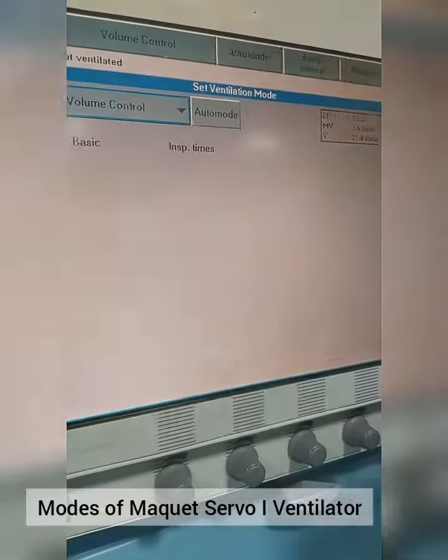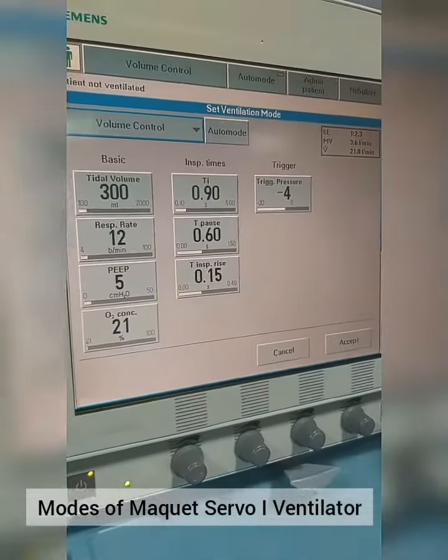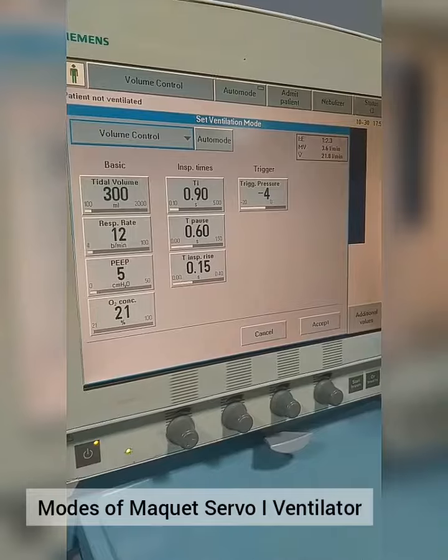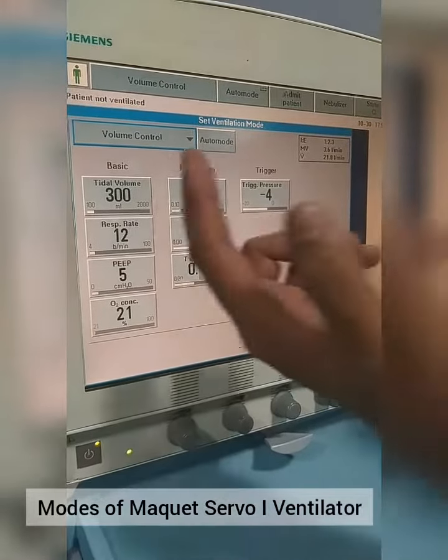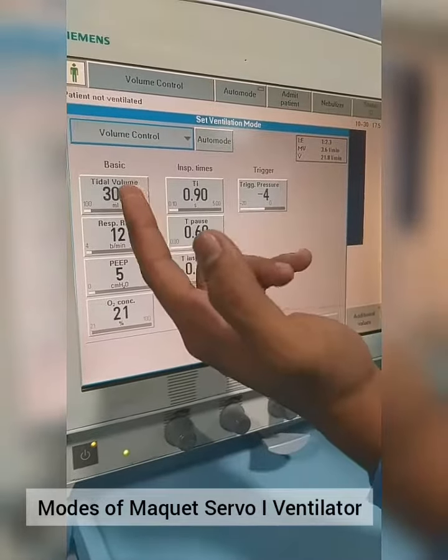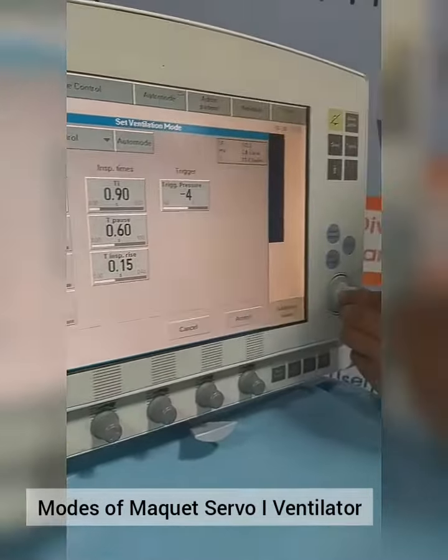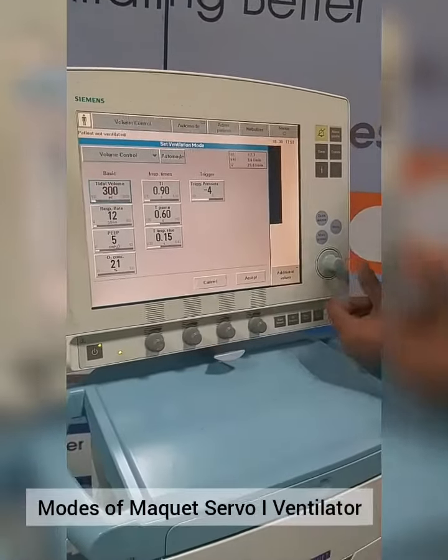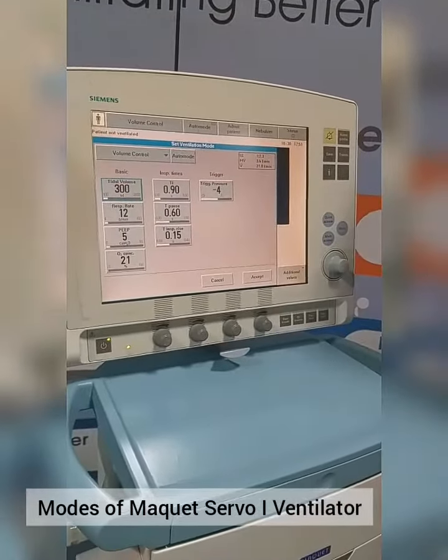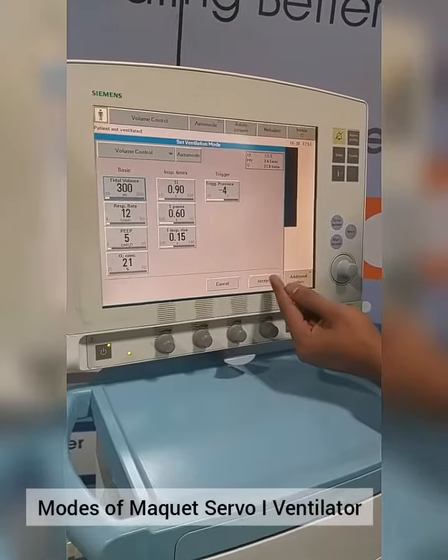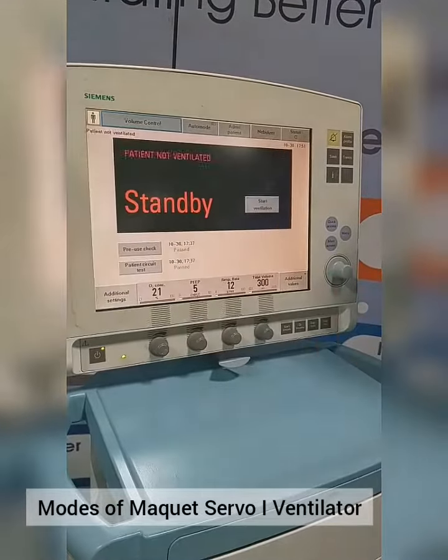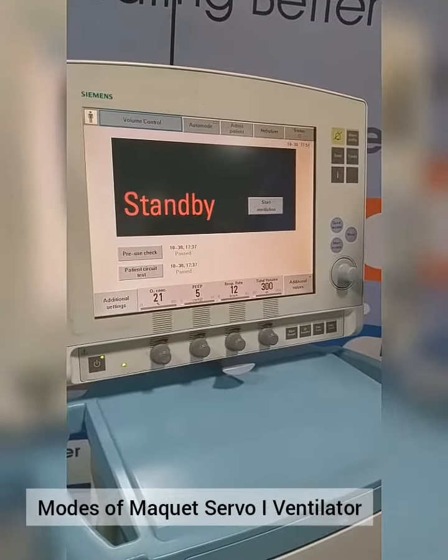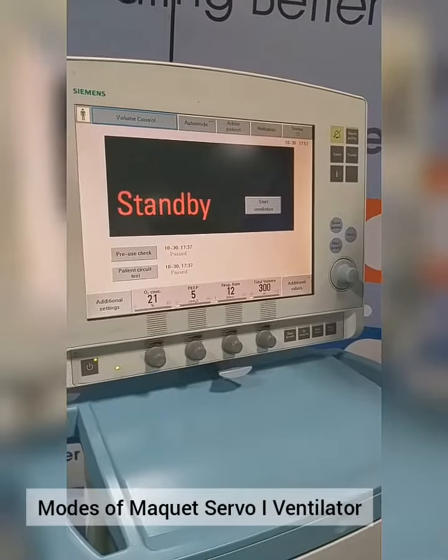Now we select Volume Control. Once after we select a Ventilation Mode, all different parameters will be shown on the screen. We just have to touch here to select the required parameters, then press the Volume knob and select Accept. The Mode with required parameters is now selected.